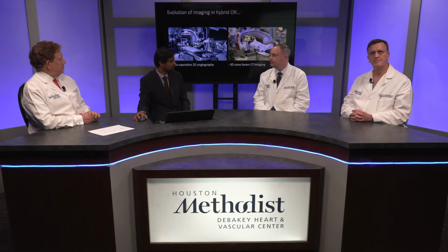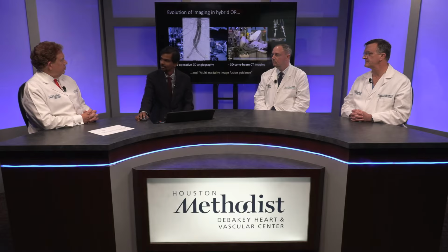So that's definitely one of the interesting backgrounds to have, and one thing at least I've observed by working here at Heart and Vascular Center is aortic disease is such a continuous spectrum of disease, so we really need to put devices and imaging all together to solve this problem. So I'm sure, Dr. Lumsden, you can recollect your days in Emory where we have done complex procedures with mobile C-arms, and we have come a long way in bringing up, the imaging has evolved so much from plain old 2D angiography to 3D cone beam CTs and multi-modality image fusion guidance.